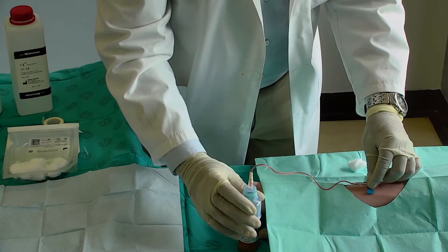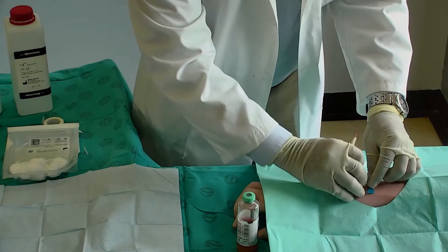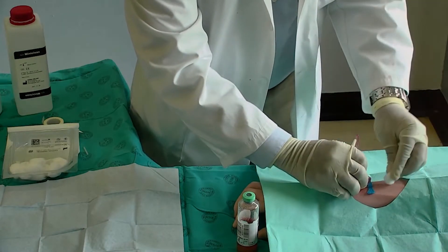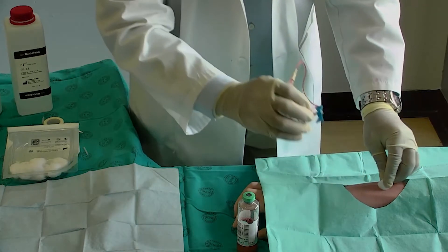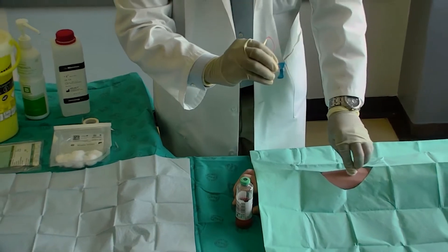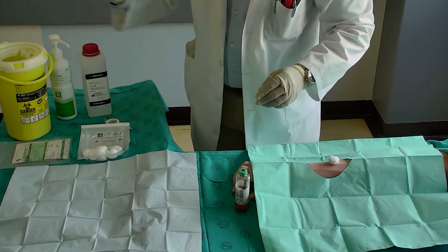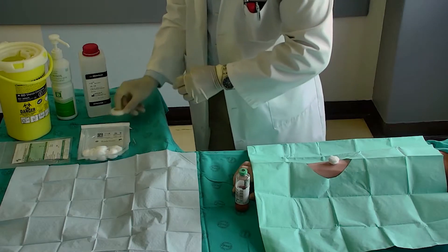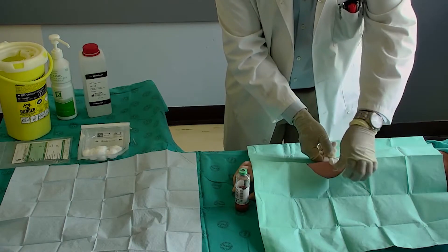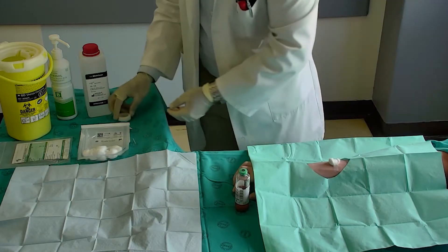Remove the culture bottle from the vacutainer. Release the tourniquet. Remove the vacutainer butterfly needle. Activate the safety mechanism immediately and apply the cotton wool ball to the puncture site. Discard the butterfly needle together with the vacutainer barrel into the sharps container. Secure the cotton ball with tape. Gently rotate the bottle.